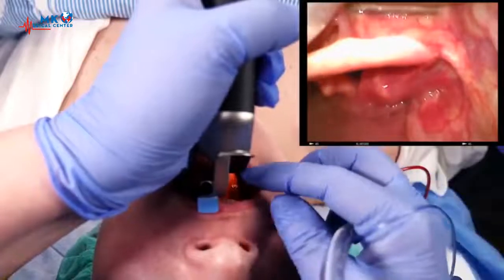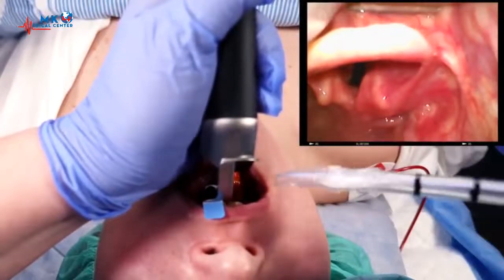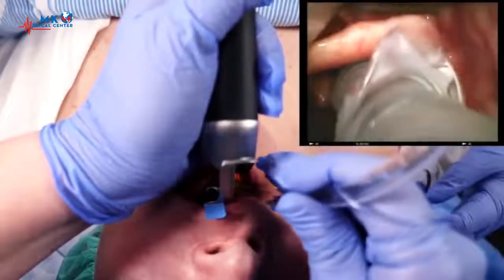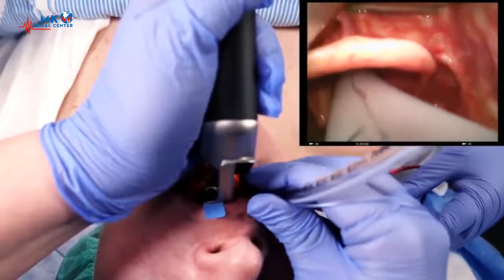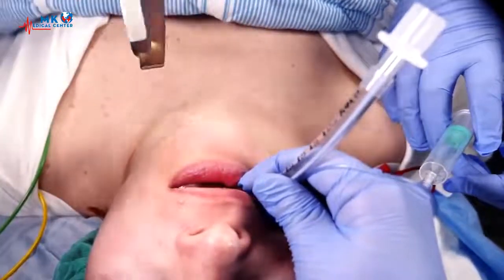By now you hopefully have a clear view of the opening of the trachea, a dark slit between the pale vocal cords. Insert the tube carefully. Sometimes a gentle rotation is required to pass the vocal cords. Advance the tip until the cuff has disappeared and the vocal cords are between the two black lines. Ask for inflation of the cuff and carefully retract the laryngoscope.